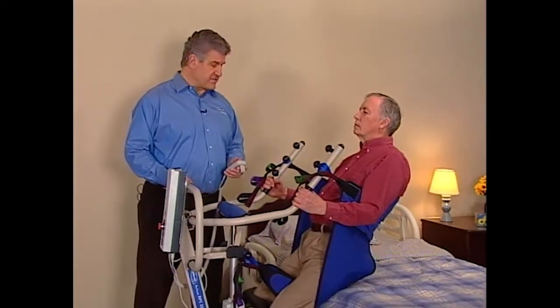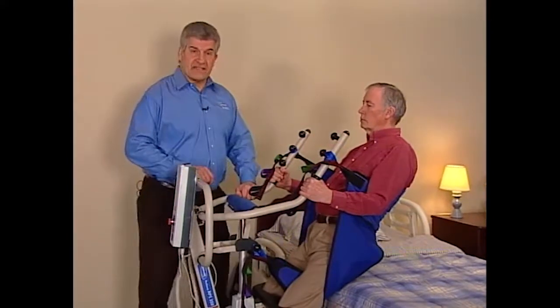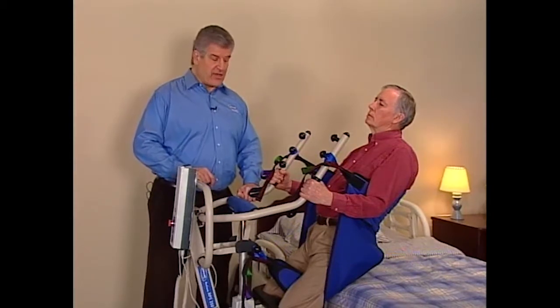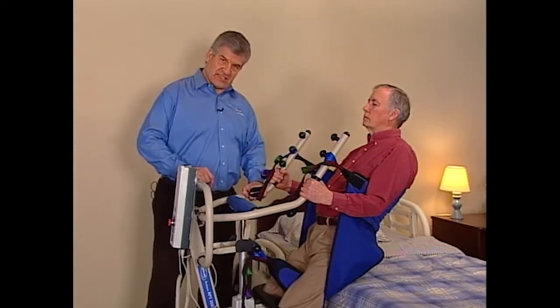Invacare's Transport and Transfer Stand Assist Slings are designed to work with Invacare Stand Up Lifts. They are designed to transfer residents who can only bear a minimal amount of weight in a seated position. They hook under the patient's legs and support the torso. Always check with the physician before selecting a sling.